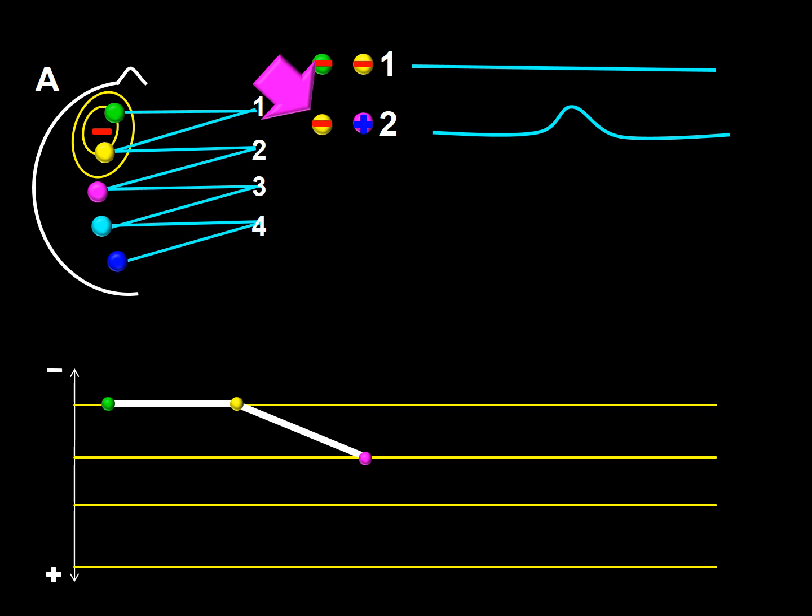In the epoch I will represent this as an up deflection in the corresponding channel, because the electrode at input 1 of the derivation is negative in relation to the potential coming into input 2.